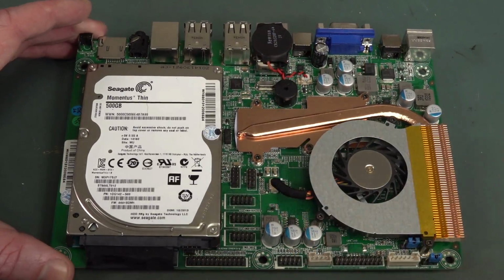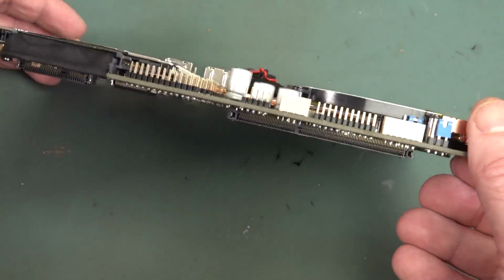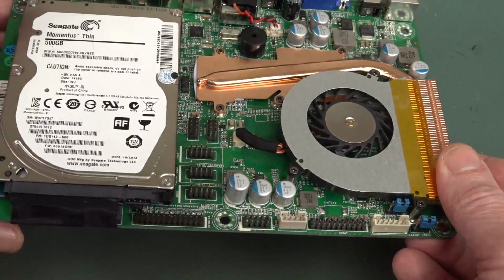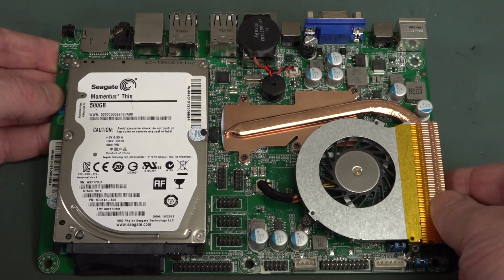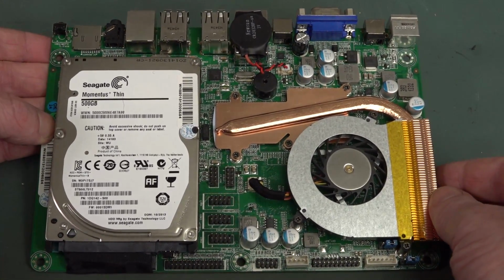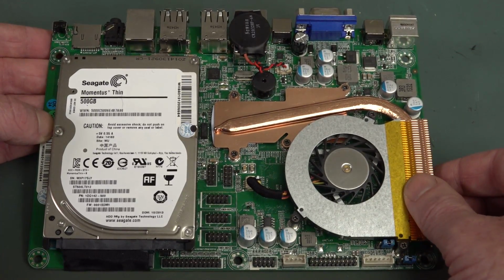obviously our CPU is going to be under there. There's our chipset, and it's just got the heat pipe going out there, and it's kind of laptopy. Yeah, that's a bore. When you salvage something like this, the machine itself is absolutely useless, but you might salvage some of the caps or the inductors or some of the SMD voltage regulators or something like that.